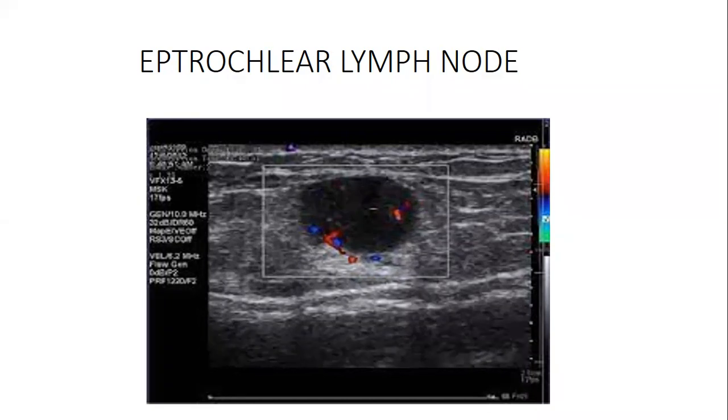The other thing that you must understand is that there are two major things you need to know about the elbow joint. Know each part that stabilizes the joint. And there are only two collateral ligaments: the ulnar collateral ligament, which is medial, and the radial collateral ligament. Please assess those. Go to the posterior part, check the olecranon and its relationship with the bursa. Come to the anterior aspect, check for the nerves, check for the brachial artery, check their insertion.